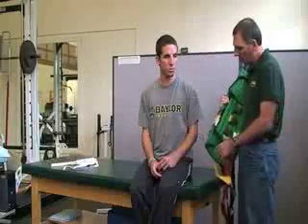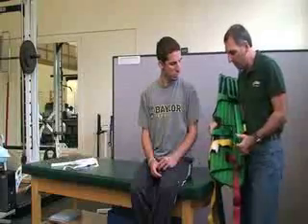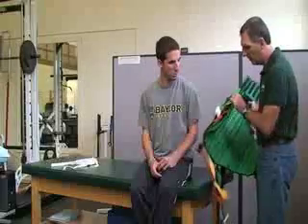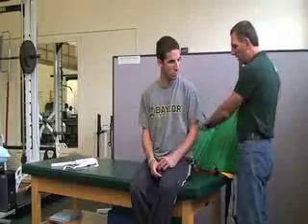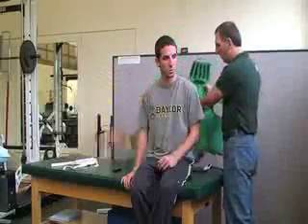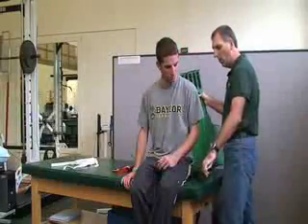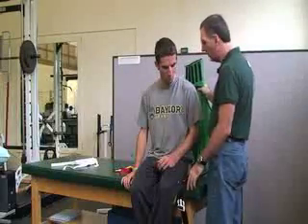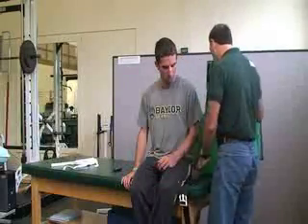With this device, we want to make sure that we have all the straps undone and the velcro released. The first thing we're going to do is attach the leg straps, and we want to try to be as delicate as possible.